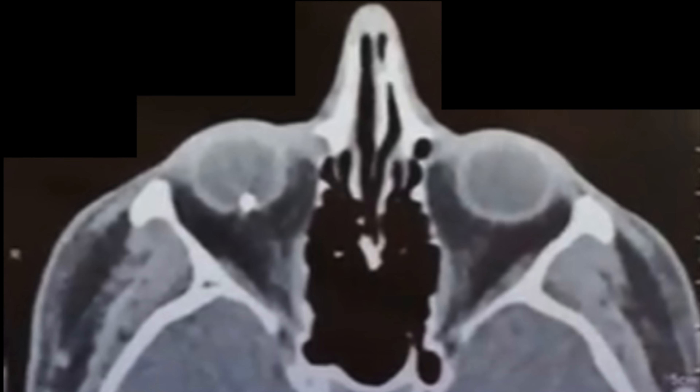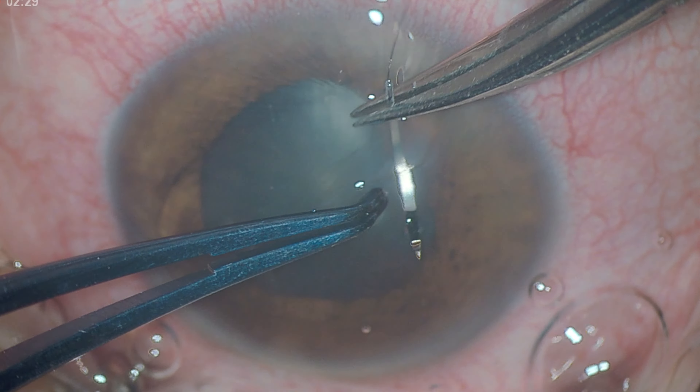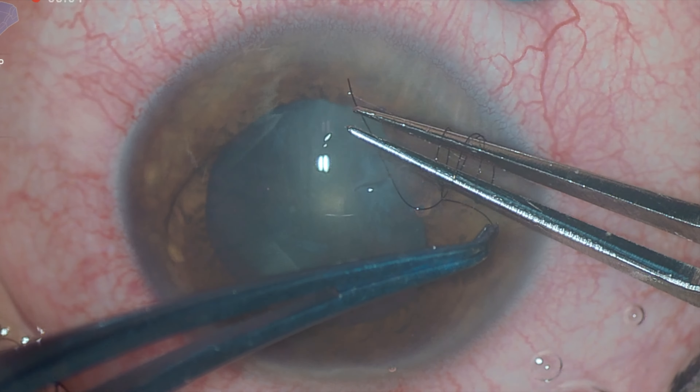This is the case of a patient who suffered penetrating trauma to their right eye with a metallic intraocular foreign body. We can observe corneal laceration and traumatic cataract, with corneal suturing performed initially.